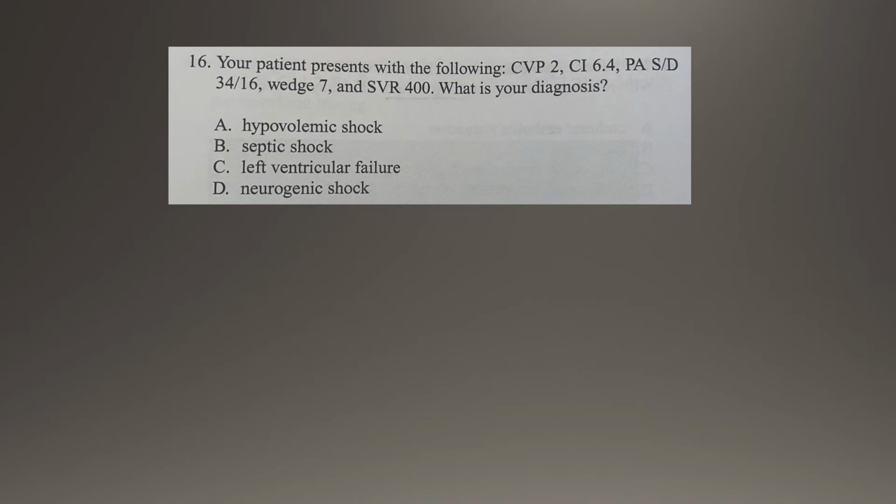All right, your CVP is low normal, so think about what would make your patient dry. Immediately, my mind's racing of thinking of how these shock states affect the human body. It's possible they're in hypovolemic shock, maybe septic shock. Then we move on to the next value. That method makes it about 10 times harder than it has to be.